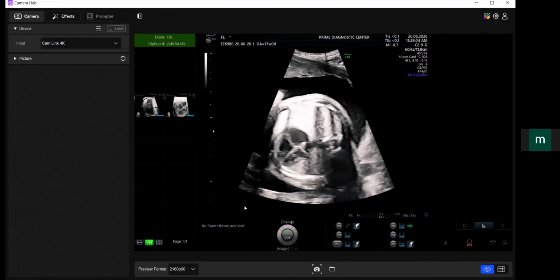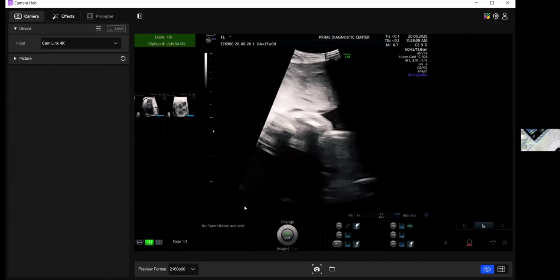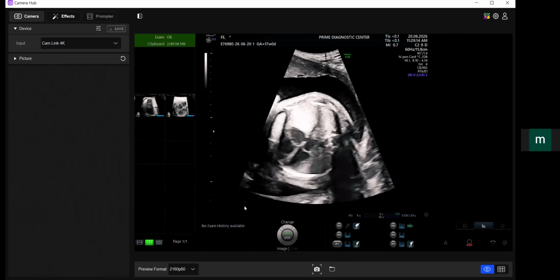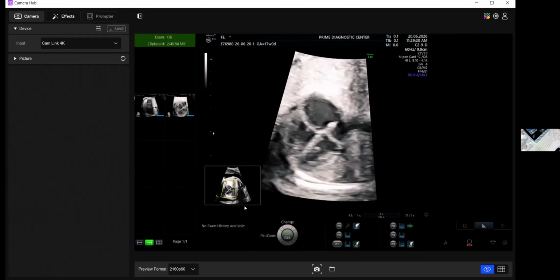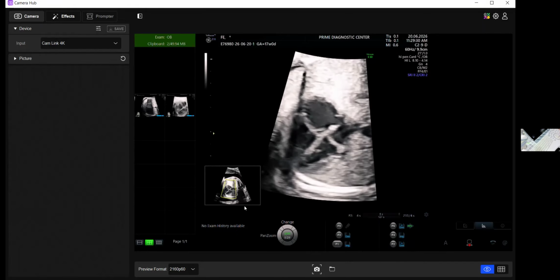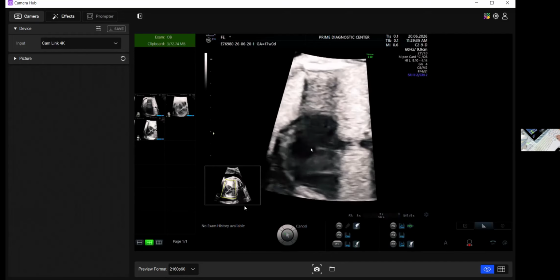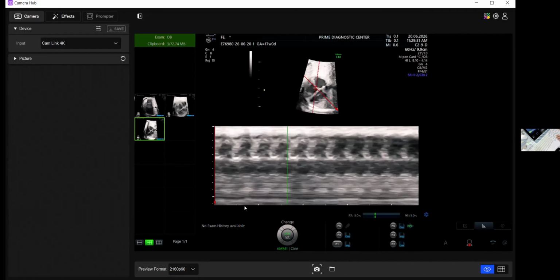So that's the answer. Sir, can you show the M mode little zoomed? I would show it in a little better position. Let the fetus be in the lateral position, and I'll try to acquire it in lateral. And then show diastolic function again. So this would be a little better setting. If it is in lateral position, it will be far better. The more the angle of M mode, the less the resolution. So here we have to angle the M mode quite a bit. So now the angle is about 90°.